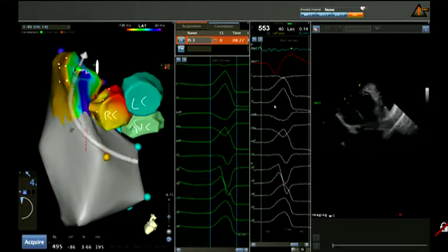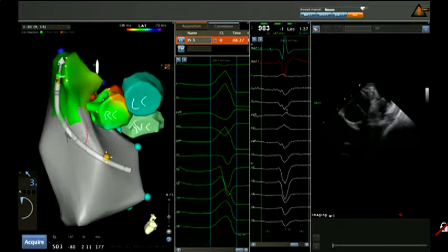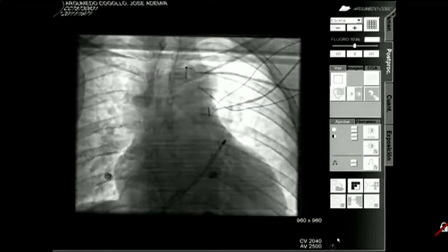Por favor, en el cuarto de control nos ponen en la pantalla principal the three-dimensional fluoroscopio. I think the mapping system helps, and you try to go to the area in the outflow tract that faces the right coronary cusp, which is right now the earliest point. The only problem we have with the right coronary cusp, the earliest spot that you see there, we think is an artifact. So I think the earliest site actually was more towards the posterior side. But right now on the right side, we haven't seen anything earlier than.